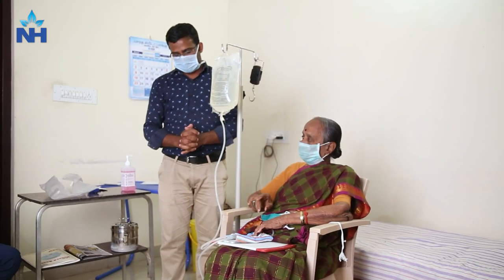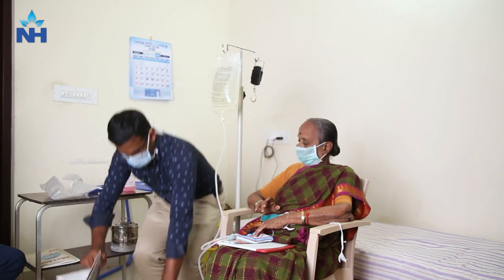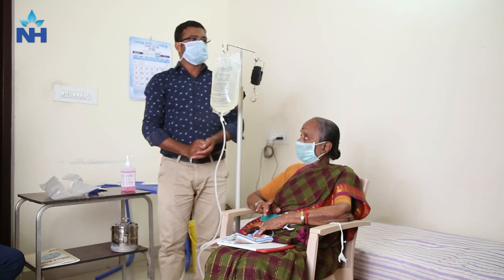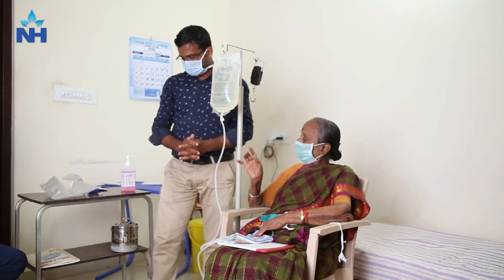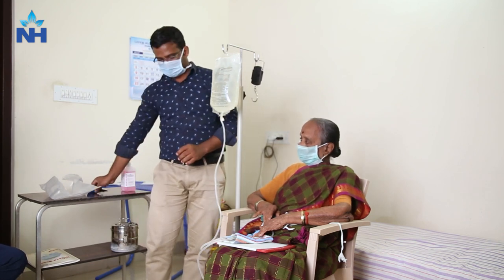In the first exchange of the morning, the patient might not have any fluid inside the abdomen, so we don't have to drain anything. In subsequent exchanges, the patient already has some fluid in the abdomen, so we drain that first and then fill in the new fluid. Mr. Vamshi is going to drain the fluid first.